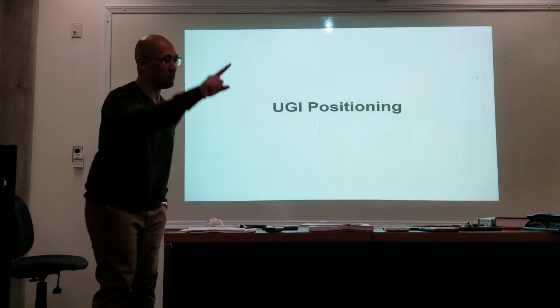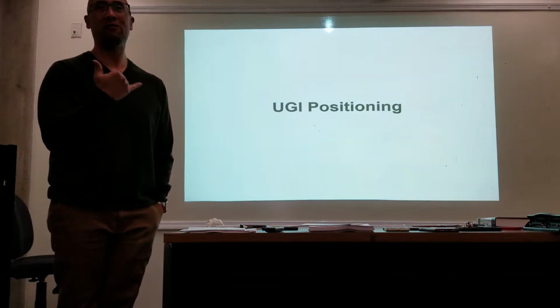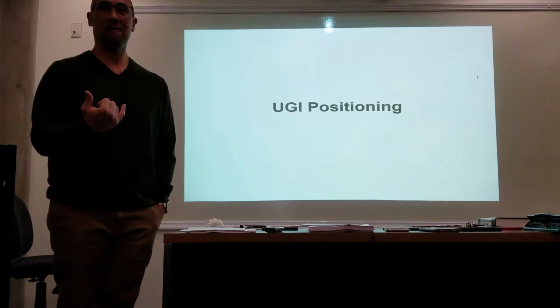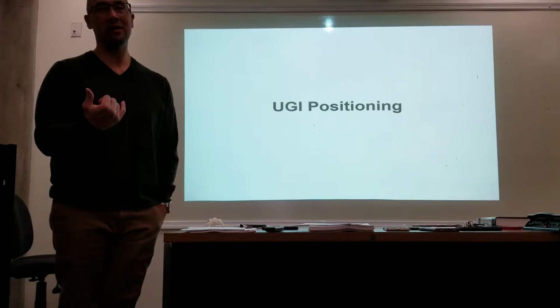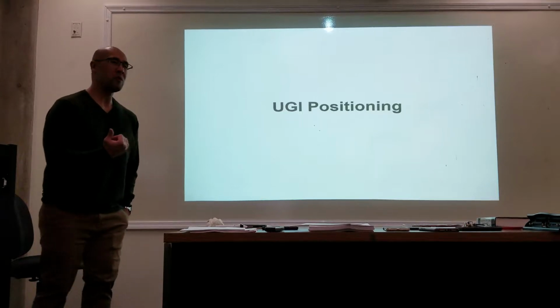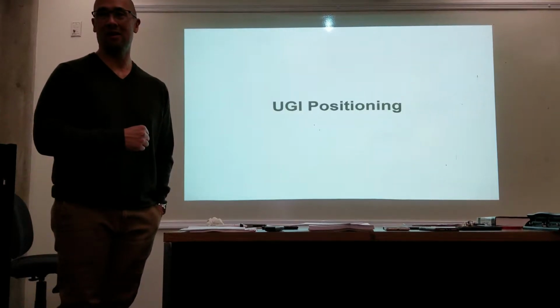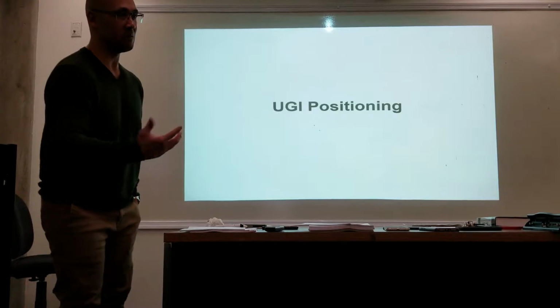Once they make a full rotation, you get on the phone and call your radiologist: we're ready for you in room 3 for the upper GI. That's your prep. During all this rolling on the table, she doesn't burp? She should not. Do they? Yes, they do. But we've given them enough gas crystals that even if they burp a little bit, there should still be some gas in there. But if it's a really loud belch, then we need to give them some more.